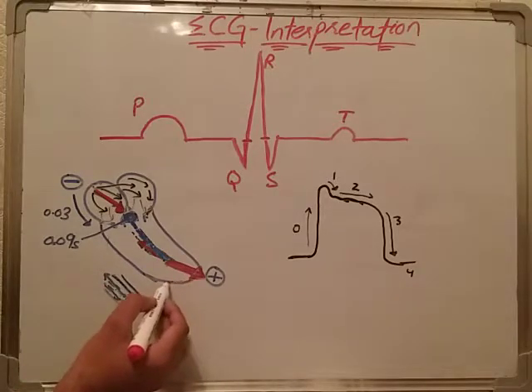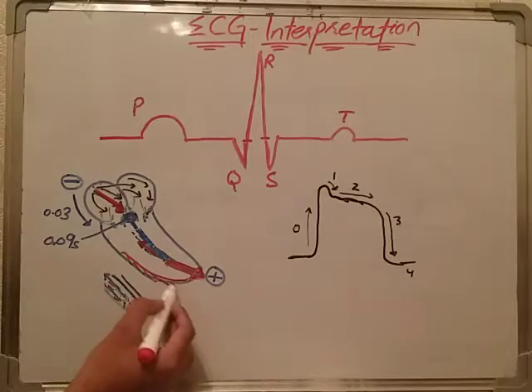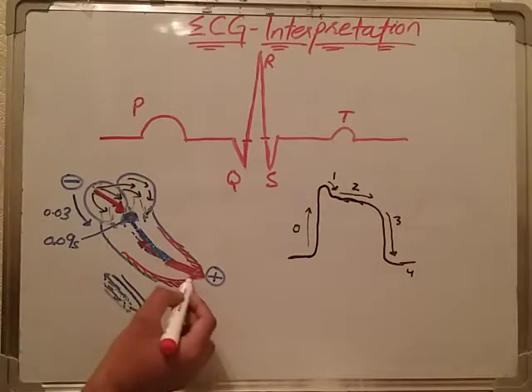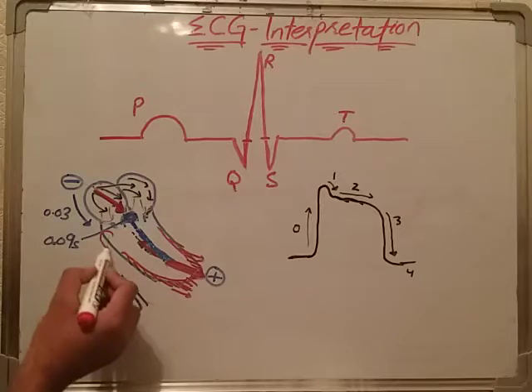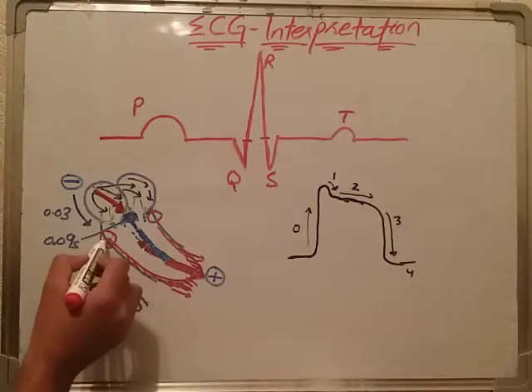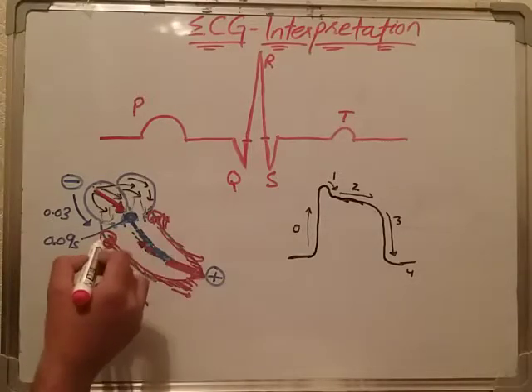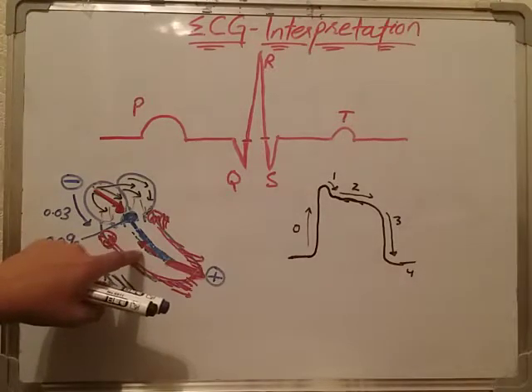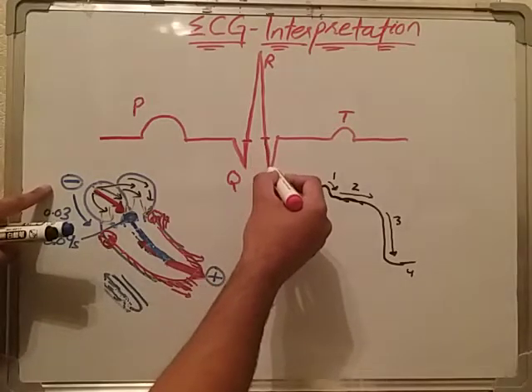After this, the Purkinje system depolarizes the muscles of the ventricles in the downward direction. It will depolarize in this direction, and at the base of the ventricles the depolarization will move upward like this. The impulses move upward. Again, as with the septum, it is moving toward negative, so we present a small curve here.